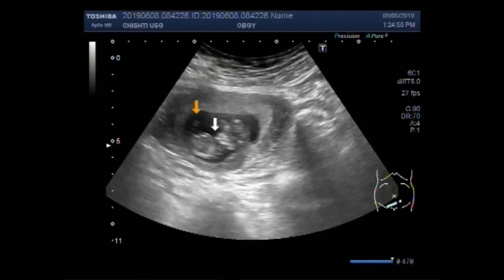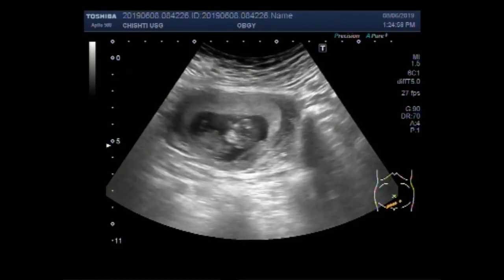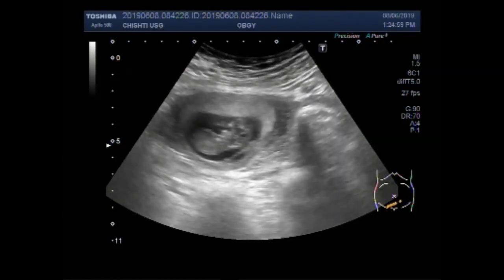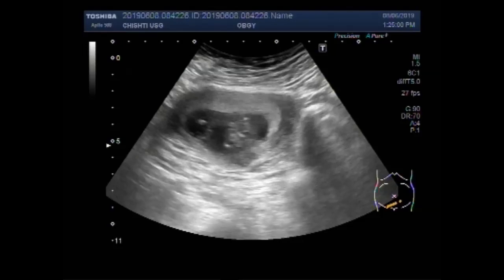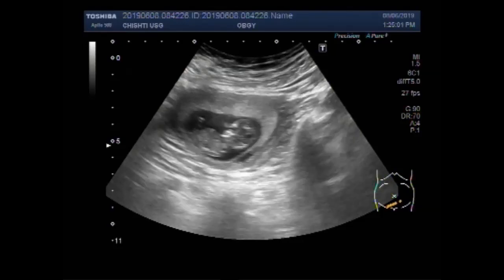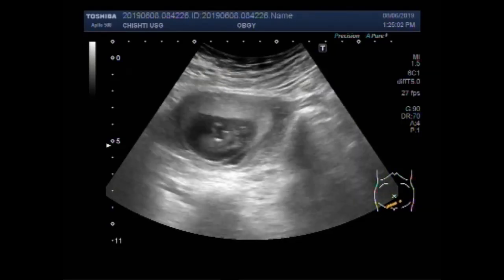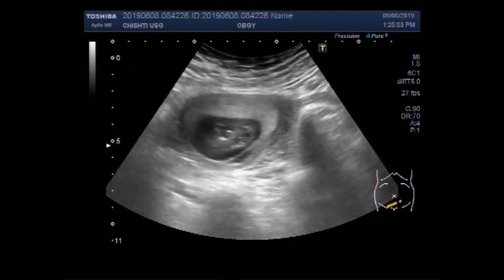This is the normal fetus and this is the small placenta. Now you can see the fetal movements and fetal cardiac activity.